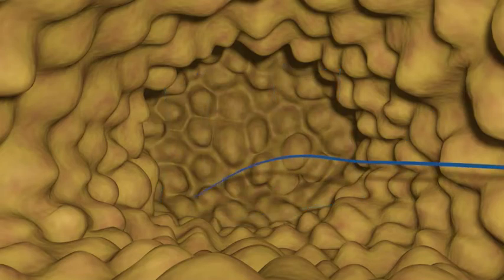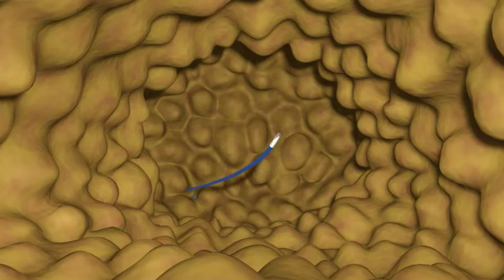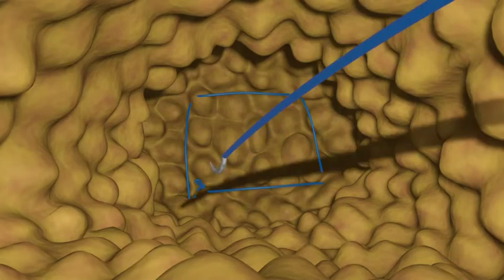A square placed in the anterior-most aspect and one in the posterior-most aspect of the lumpectomy cavity can be very effective. This allows for marking of any additional margins as appropriate to the planned surgical approach.